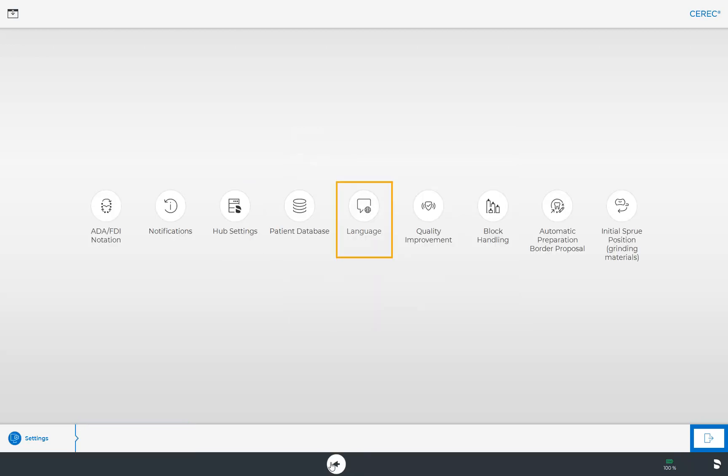By tapping the language option, you can define the language of your software. Next to it is the Quality Improvement button. Here you can turn your participation in our quality improvement program on or off. By turning on this option and providing feedback, you can contribute to the further development of the CEREC software.